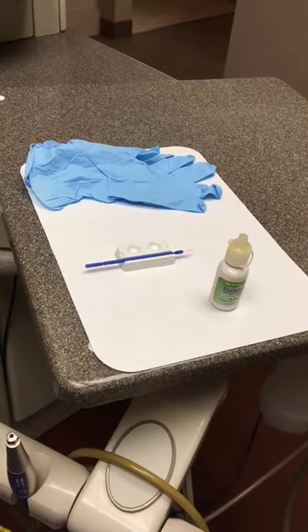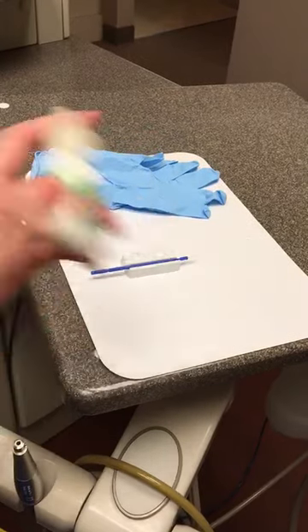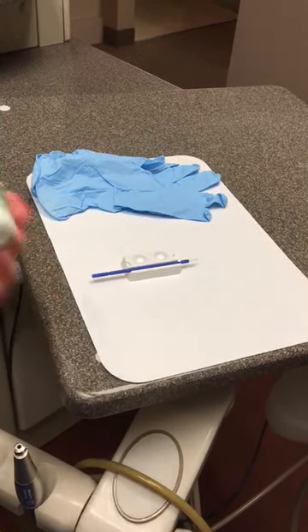We're going to show how to apply Florimax fluoride varnish. The first thing you want to do is shake the bottle for about 15 seconds.